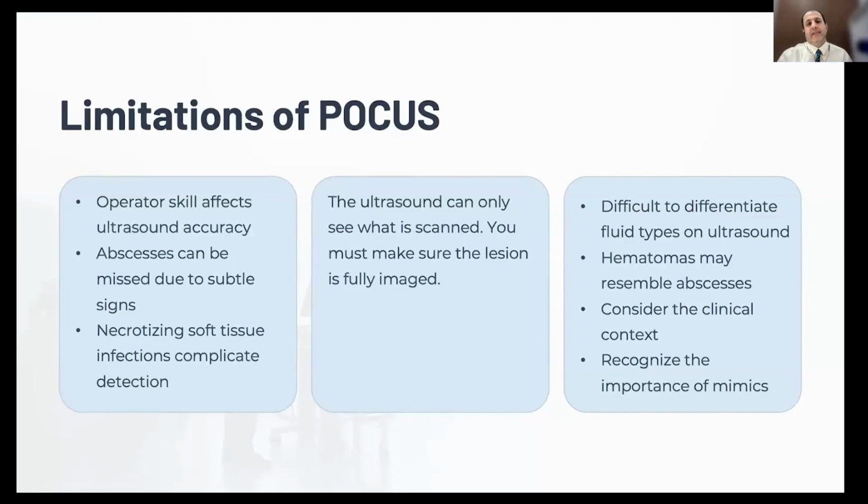With all these good things that we discussed about the ultrasound, our friend the POCUS has some limitations. It is really dependent on who is doing the ultrasound. It's operator dependent. So that's why we need to learn and practice to improve our skills to be the most efficient physician using POCUS. If you are not that skilled and trust your study, you may miss something.